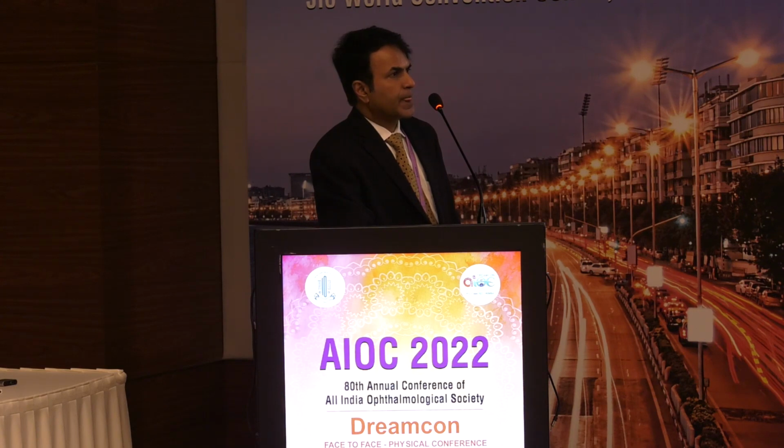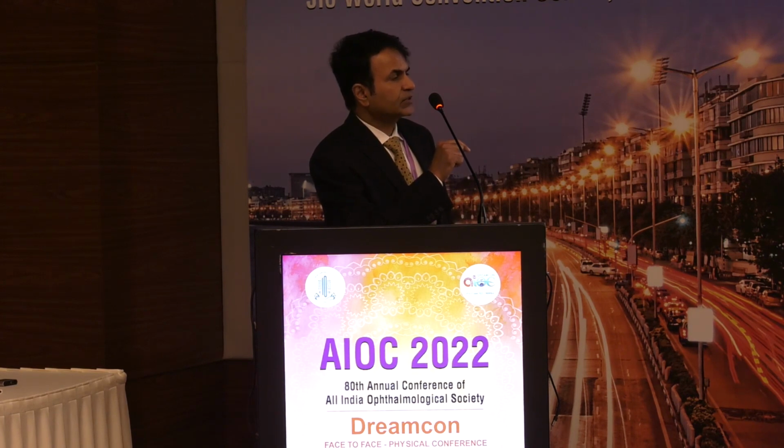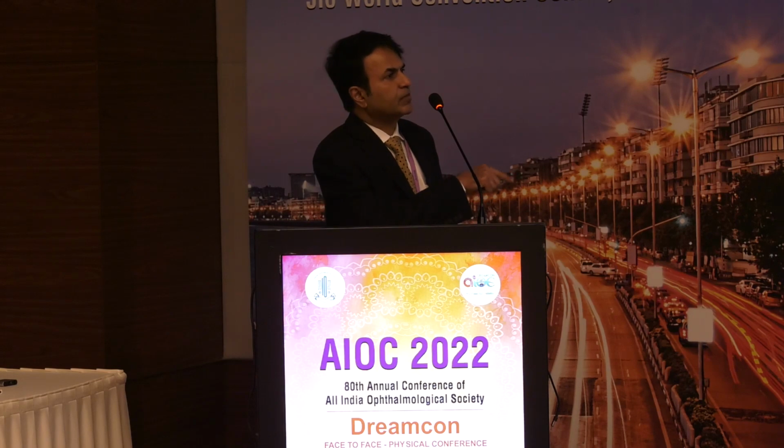What do you mean by a cryo-assisted biopsy? Cryo-assisted biopsy is used when you have a vascular lesion, especially when you're doing biopsy under local anesthesia. If you simply make an incision within the lesion, it will start bleeding. And also you cannot hold the lesion with forceps because then there will be crush artifacts. So we use a 3 millimeter cryoprobe, freeze the lesion, and make the cut around that. Cryo temporarily anemizes the lesion because it causes constriction of the blood vessels. So when you cut around the ice ball, cryo is holding the lesion, so you're not holding it with forceps. And because you're cutting around the ice ball, there is minimal bleeding. Then you use the same cryoprobe to go a little deeper and a little deeper.